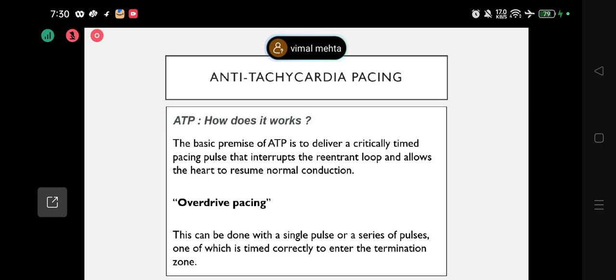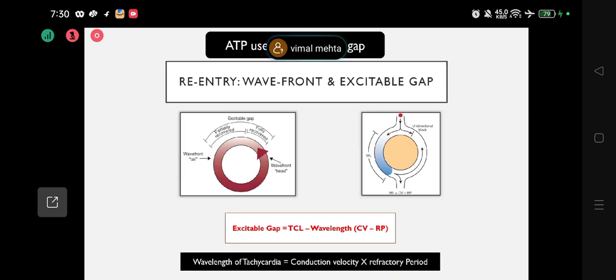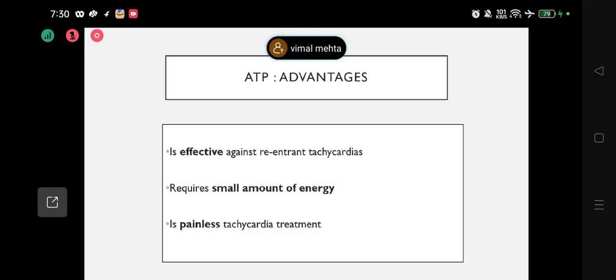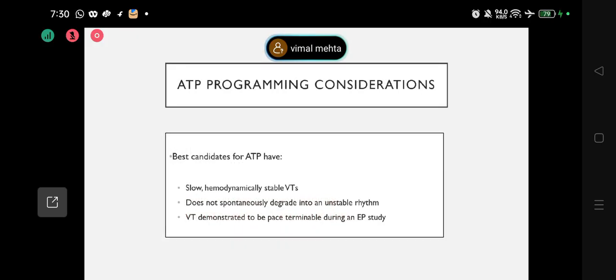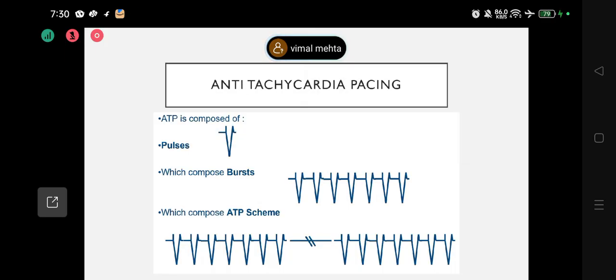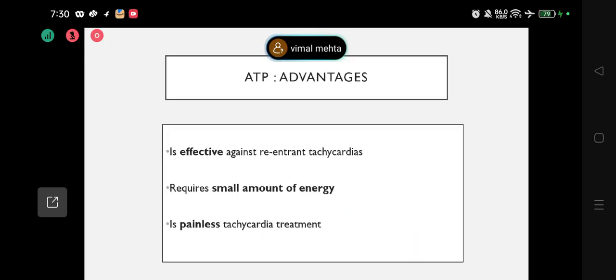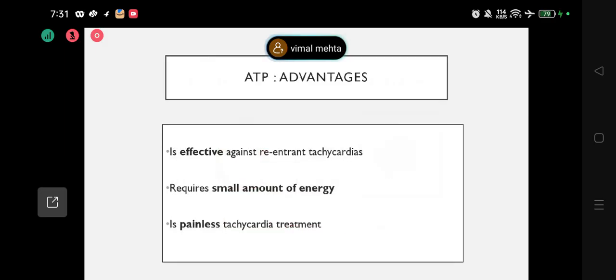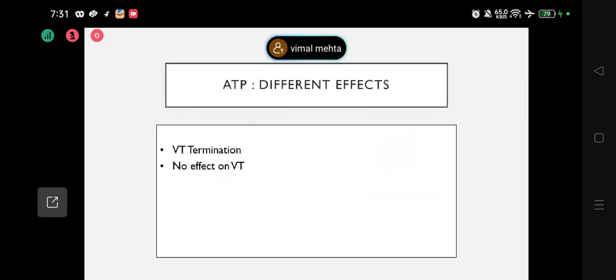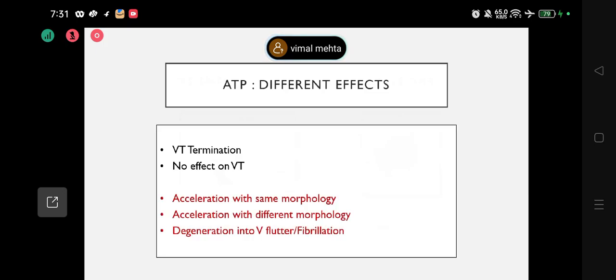One of the basic principles of cardiology is that the heart runs on one simple principle: every tissue of the heart, every cell in the myocardium, whether atrium or elsewhere, can activate the others. But some are faster and capture the others. So if you pace faster, you override it, and after that you simply break it and it will get broken. If not, then a shock will be delivered.